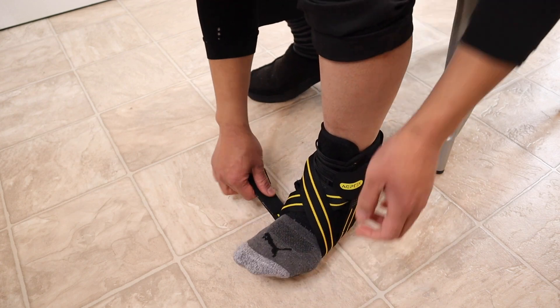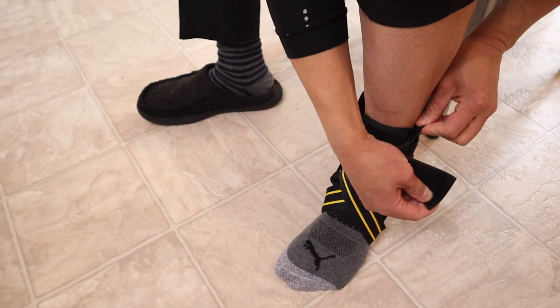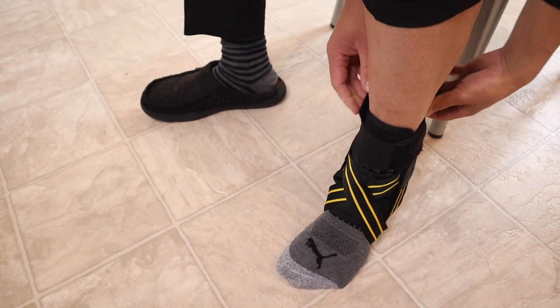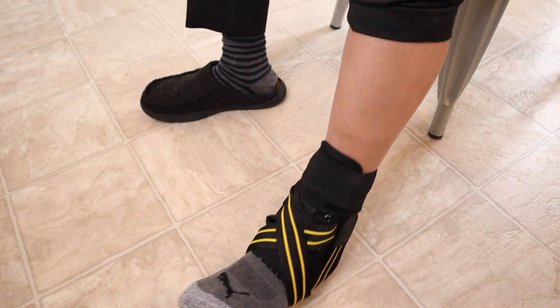Then you're going to do the same thing with the left pressure belt. Lastly, adjust the tightness of the horizontal straps according to your calf circumference and make sure it's stuck really nice and well.